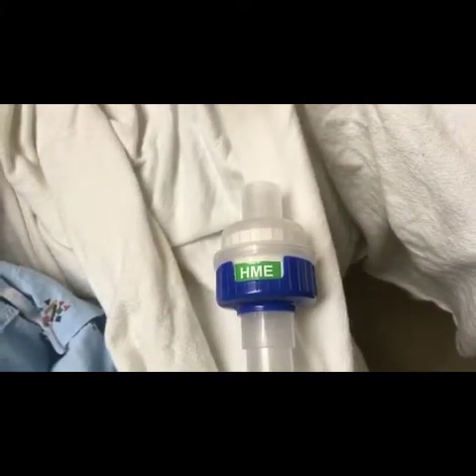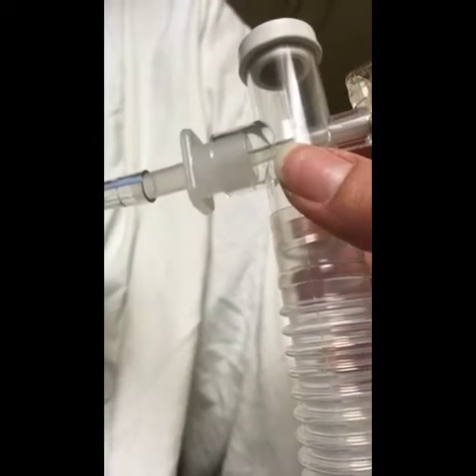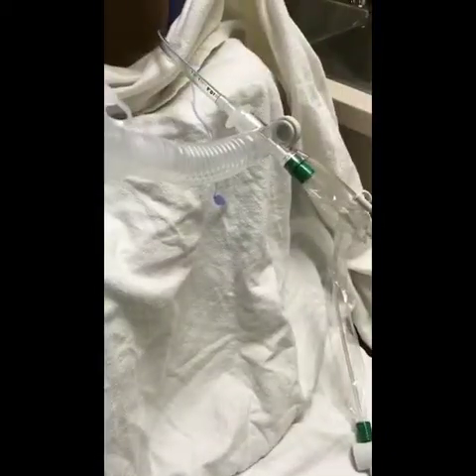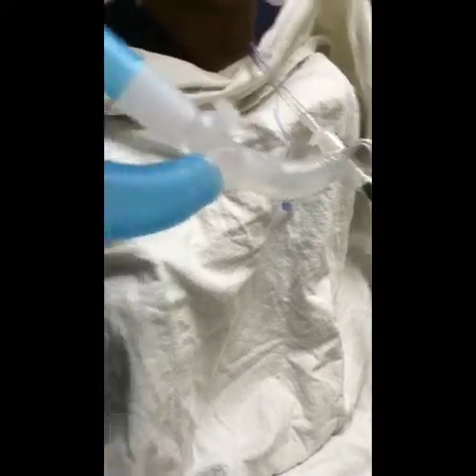The site of the HME is one of the most common places for a circuit disconnect. For the patients who've been intubated for a long period of time, it's also possible for the circuit to disconnect at the ET tube hub. Remember that anytime you have a significant leak anywhere in your circuit, a low pressure or circuit disconnect alarm will occur. It's important to check the entire circuit, starting with the patient, to be sure there are no leaks.